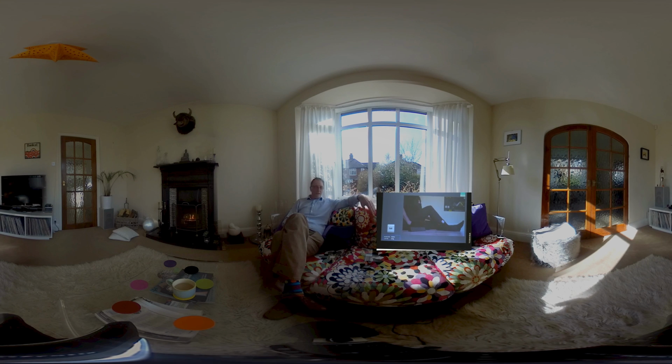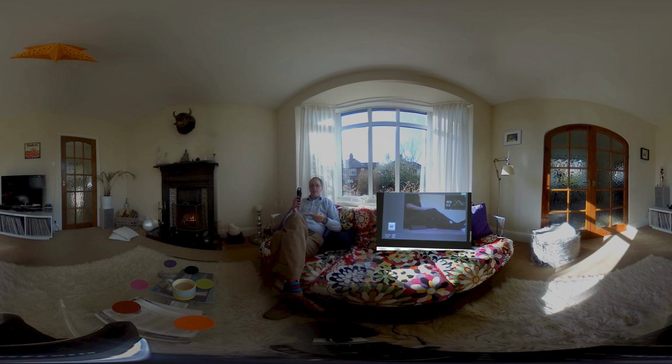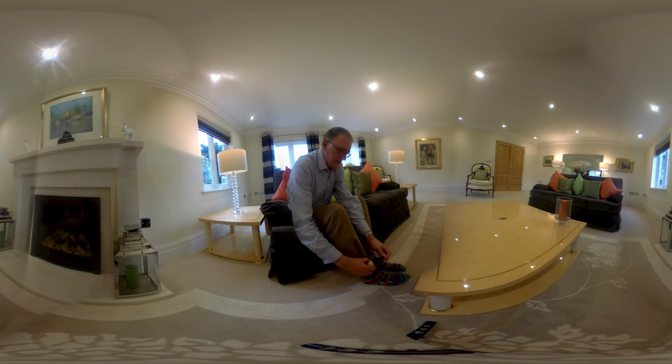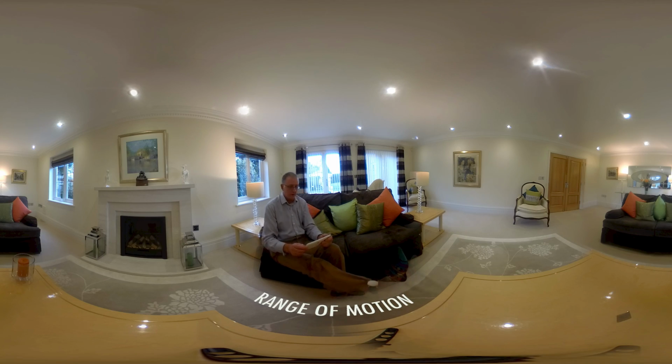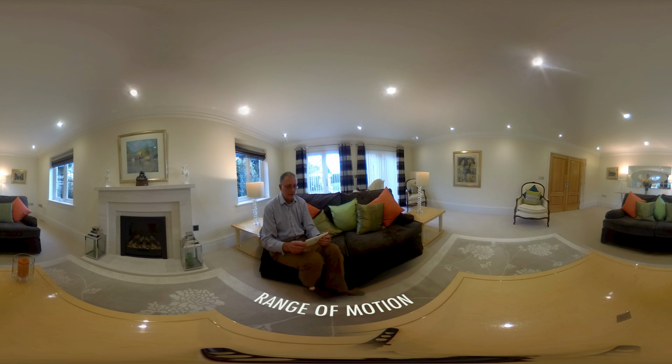As you go home, you take with you a bag, and in the bag you get these little devices. It is a tablet, and this is what's called a range of movement device. This you strap to the leg and you go through the movements that you're expected to do by the physiotherapist. This is monitored back at the hospital, so they make sure that A, you're not doing too much, and B, you're not doing too little. Because what they want you to do is to be able to bend your knee to get a good range of movement. And the only way you can do that is to follow the instructions they give you.